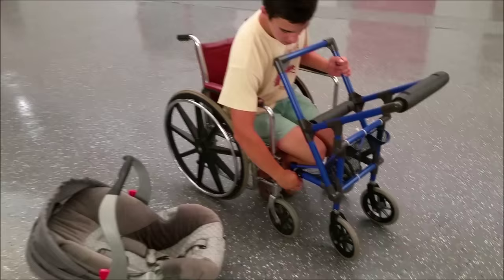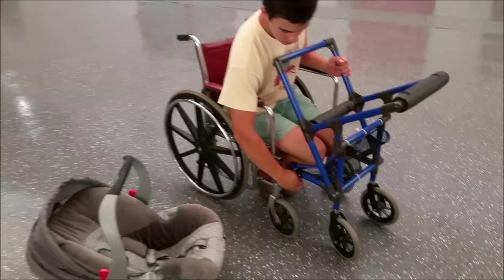It uses bike quick releases, so all you have to do is flip it right here, and then flip it right here, and remove the frame from the stroller.